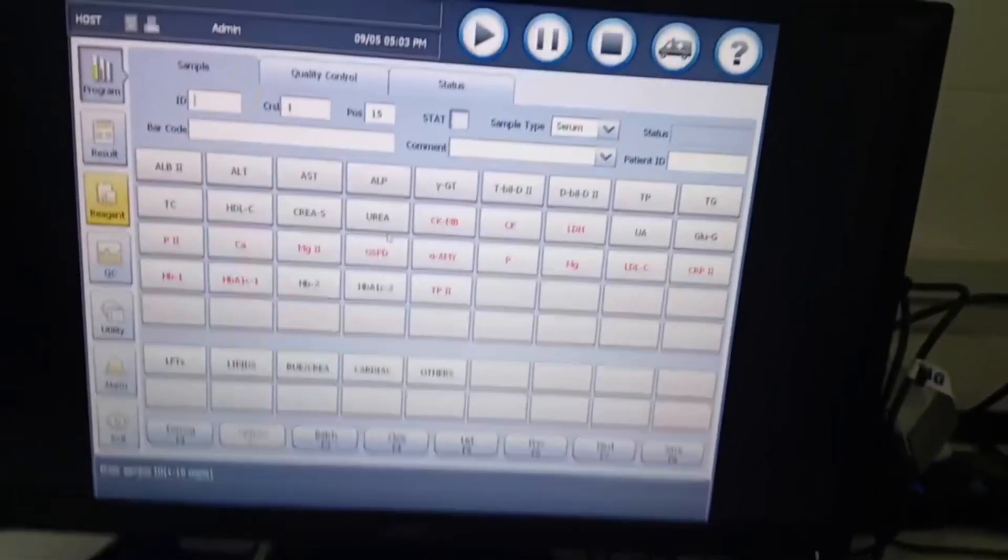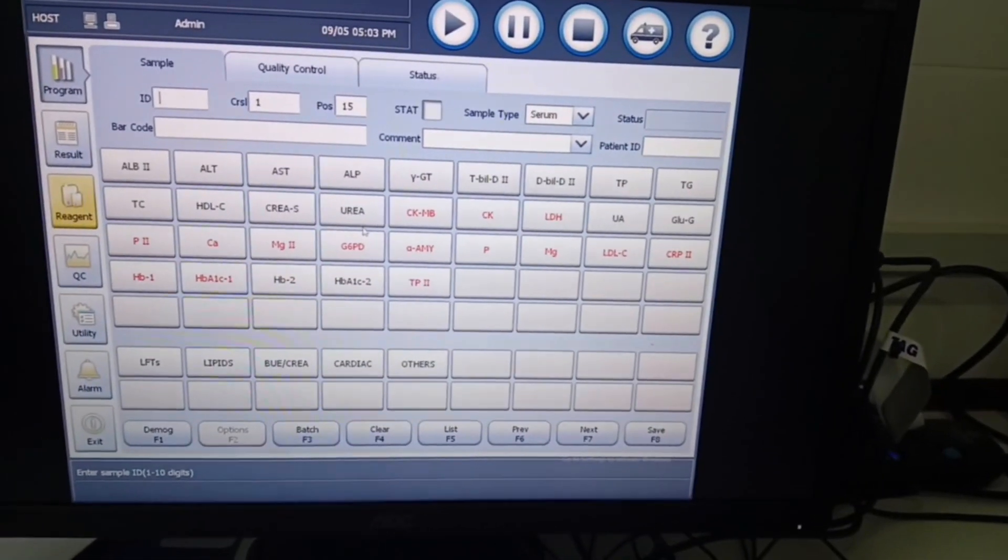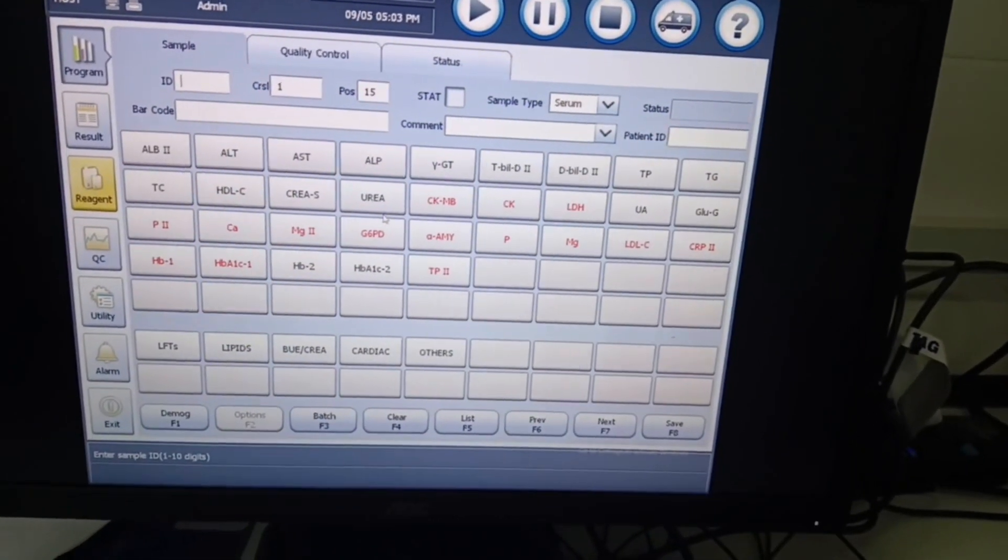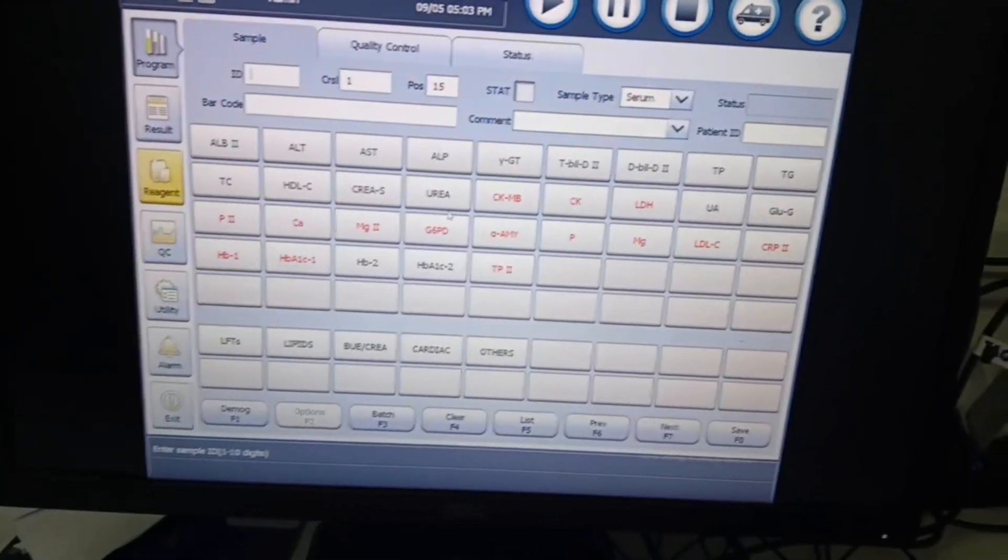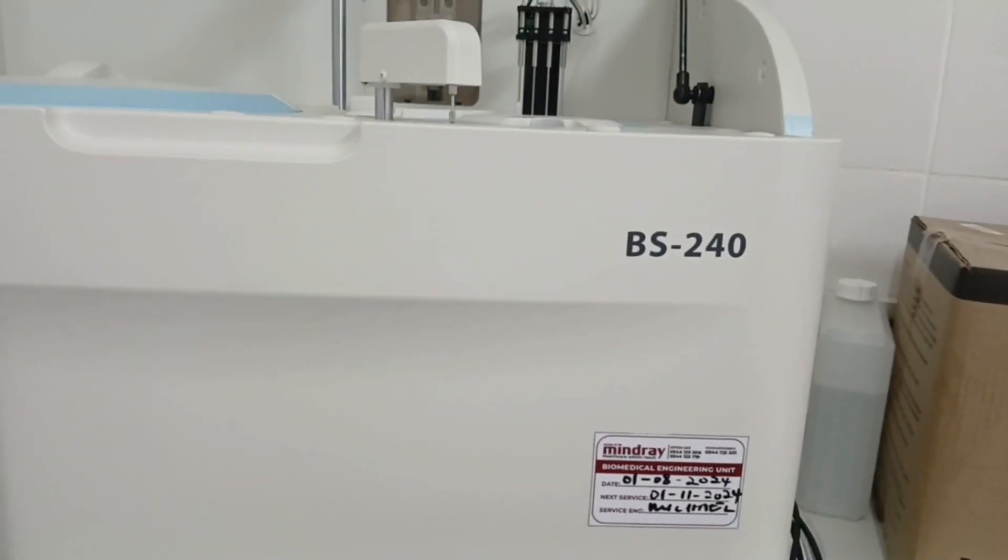So we will be running an HbA1c test on our Mindray BS240 chemistry analyzer.